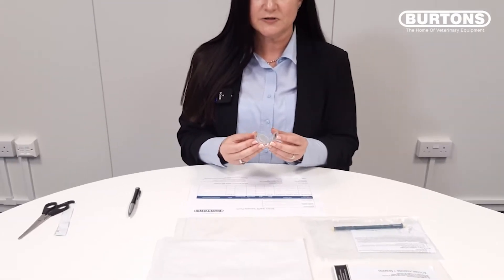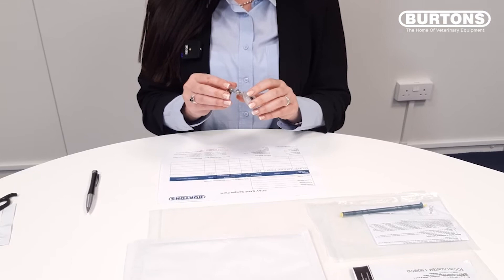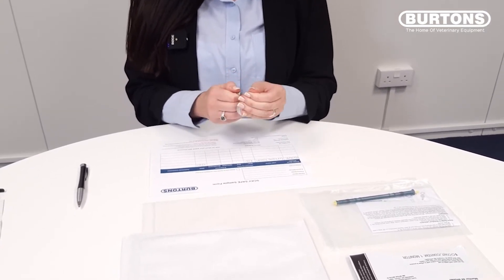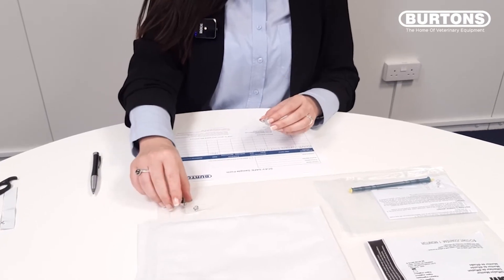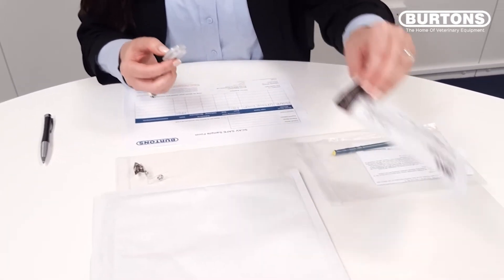Once the monitoring period has finished, remove your badge. Close the cap securely and remove the clip. Place the badge into the foil pouch.